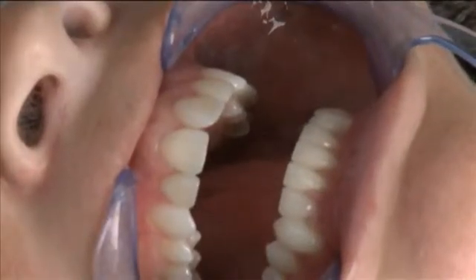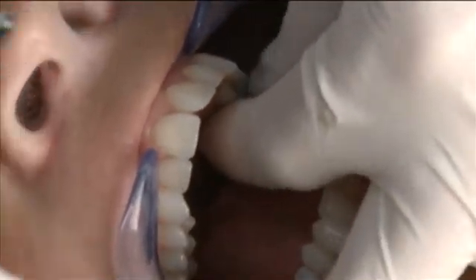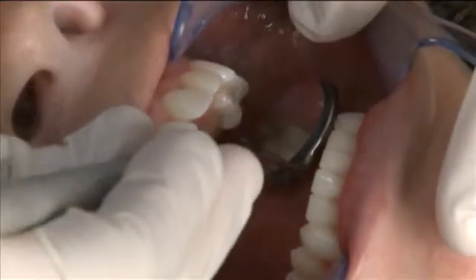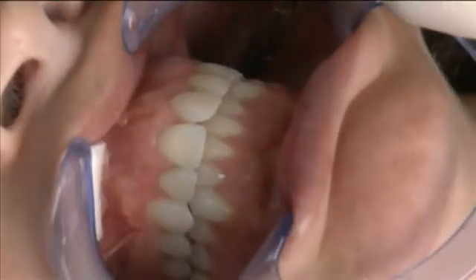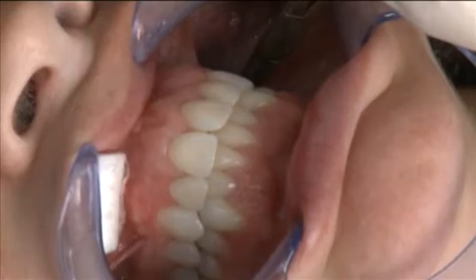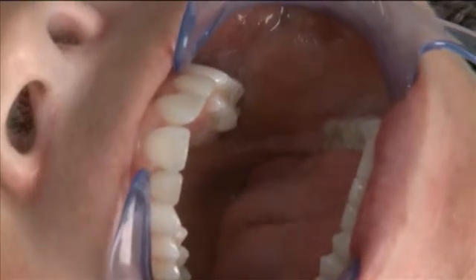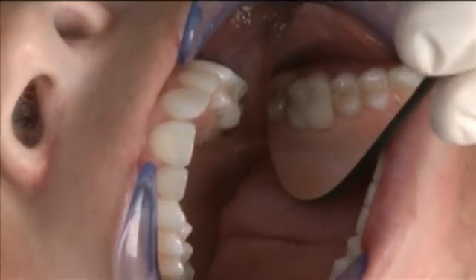Now that the restoration has been milled and the sprue has been removed, we're going to do a dry try-in to verify the marginal fit and also the occlusal fit. I've got it fully seated, and I'm going to have Laura go ahead and close on that shim stock in the same location that the holding contact existed before. That holding contact still does exist distal to the restoration, indicating that the static occlusal relationship is correct. Now I'm going to take a larger mirror and let you take a glance at the marginal fit.